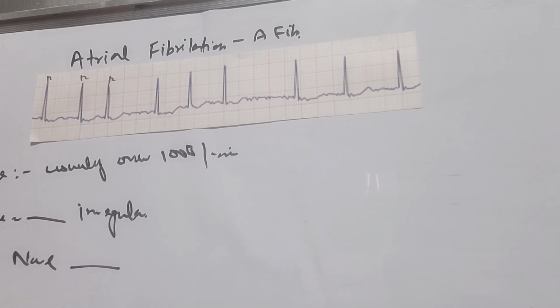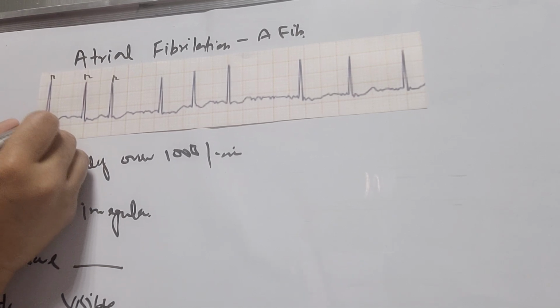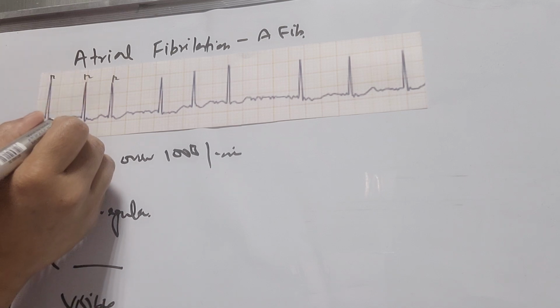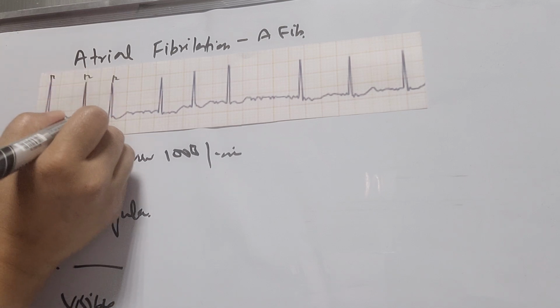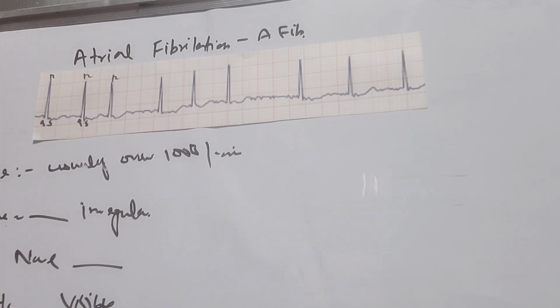PR interval not visible. QRS complex normal. See, QRS. All QRS complexes are normal.